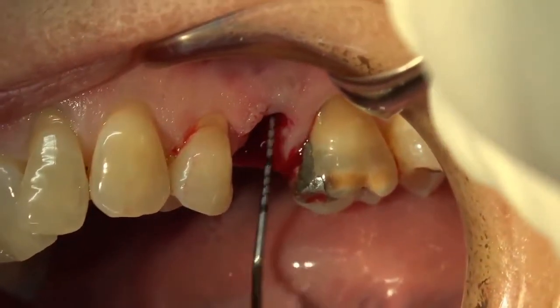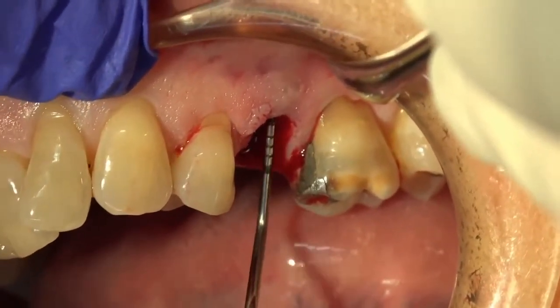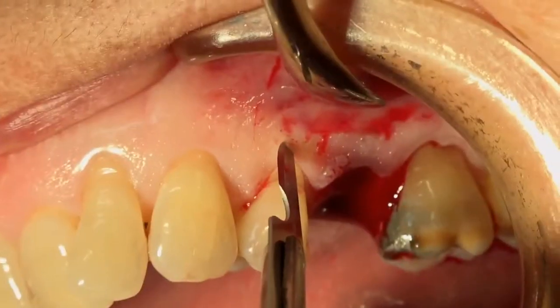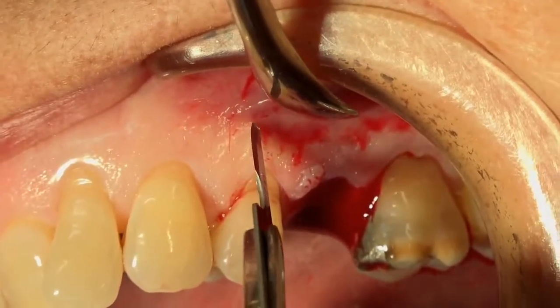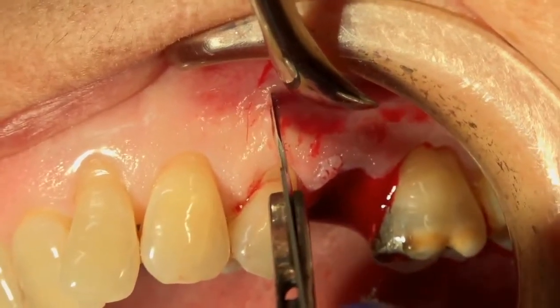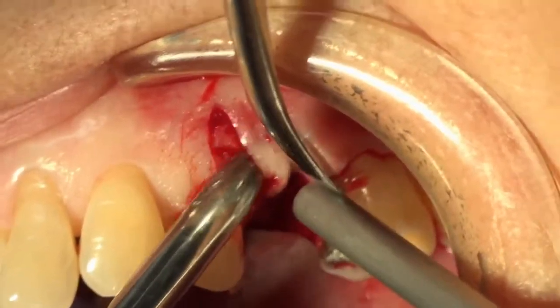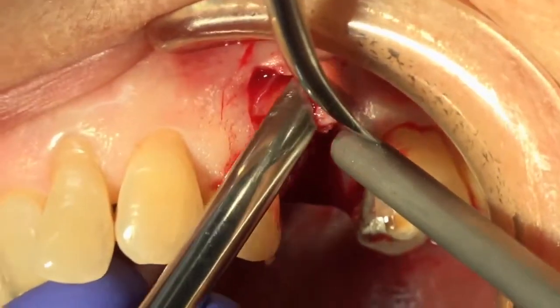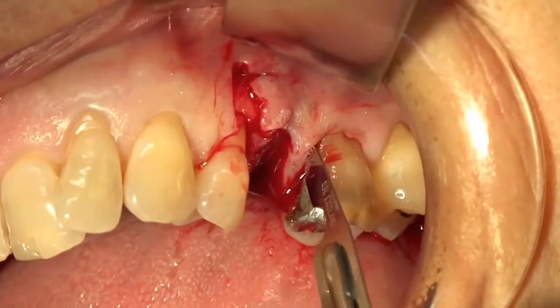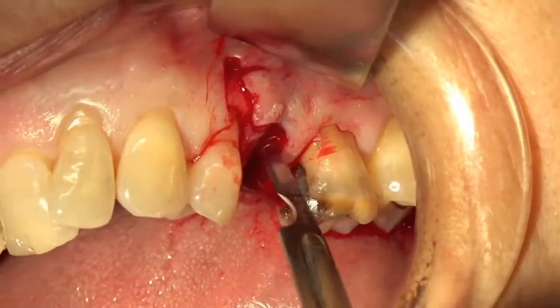And here, as you can see, there is no buccal plate. Therefore, we must reflect the flap. And the protocol for flap reflection is very simple. What you do is a mesial vertical cut until 2 mm into the mobile mucosa, not more than this. Then you raise the flap until you see the entire defect. It's very important to see the entire defect.